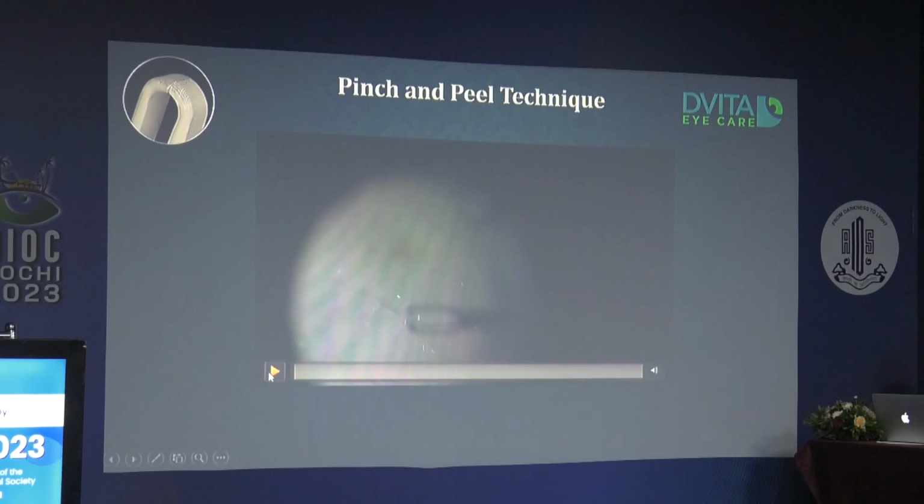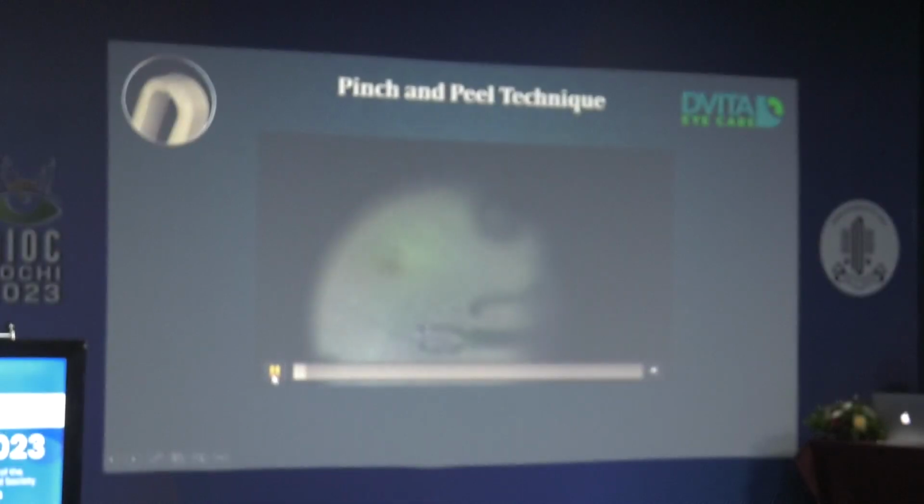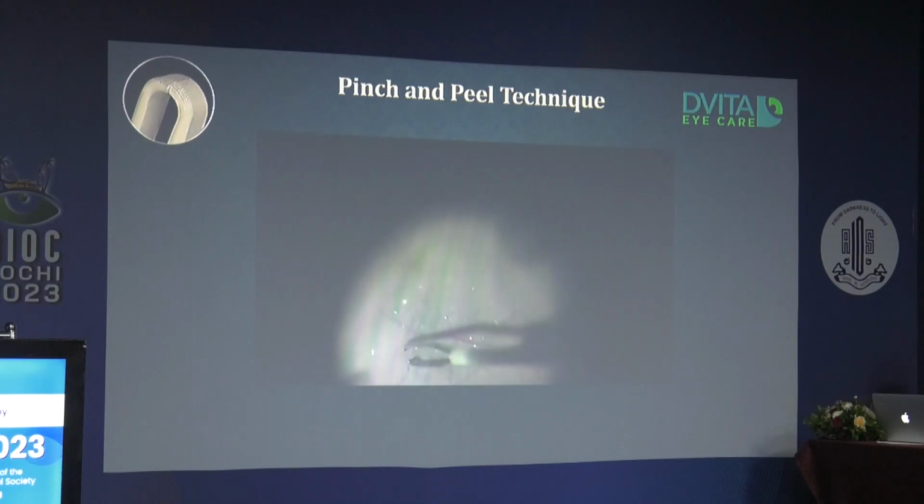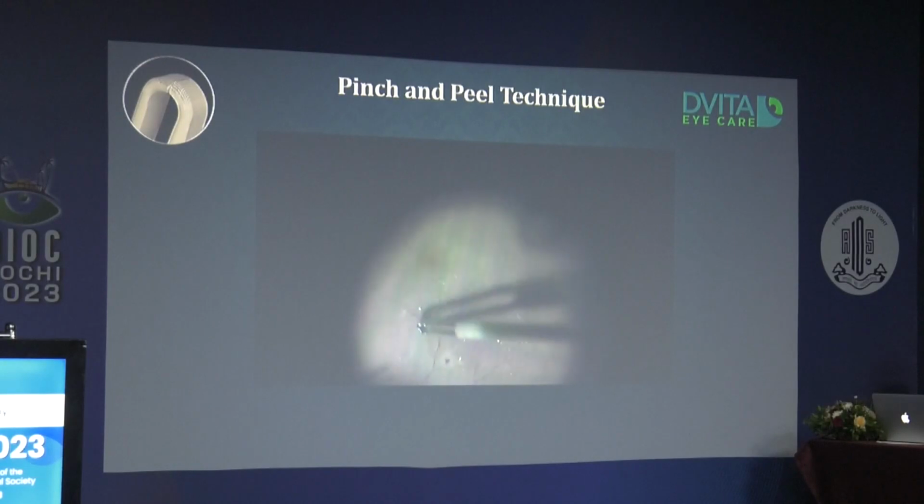So this is another video, same thing. We first pinch, release, and then again grab and make a nick over the membrane, hold the margin of that membrane, and gradually start the peeling over the retina.